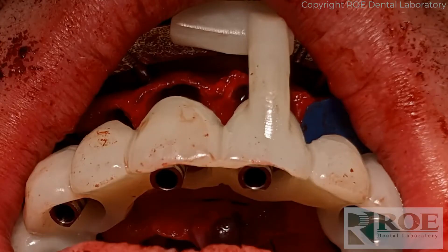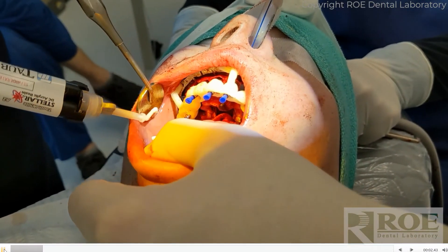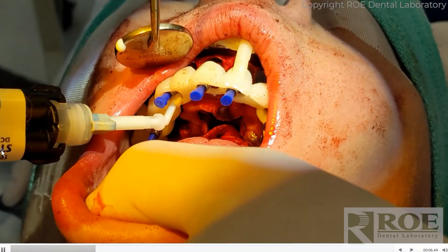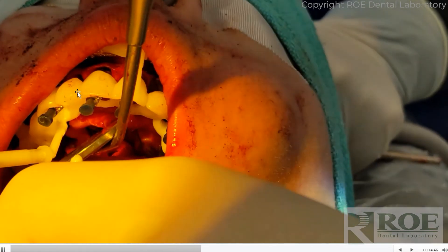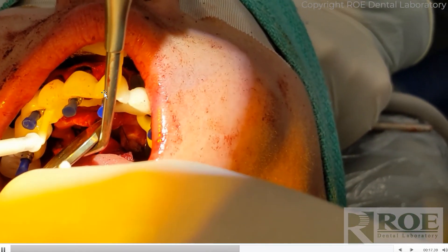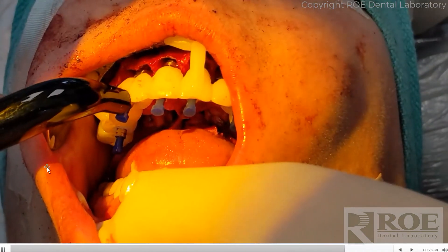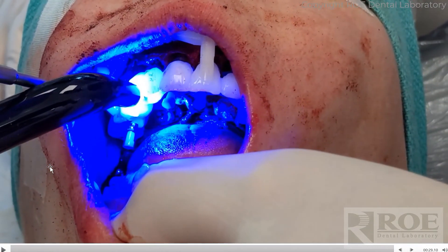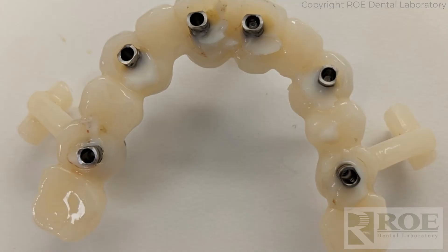We picked 2.5s and 3.5s — the lowest possible — placed temp cylinders, placed the gaskets, and since there's no carrier guide, we rely on those gaskets to protect the MUAs and then put in the plugs. A little trick: use white stellar material, place the tip about halfway in — no further, you don't want material contacting an abutment. Add the material circumferentially around each site around each temp cylinder. The doctor expressed material and hit it with a light, then repeated. Normally recommend putting material in every one of them and hitting them all with the light — a little more expeditious.